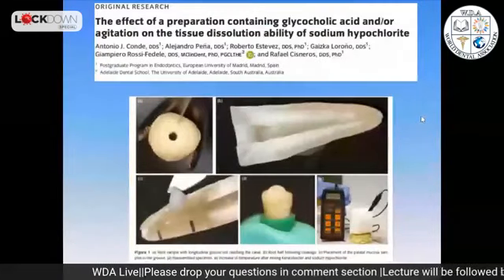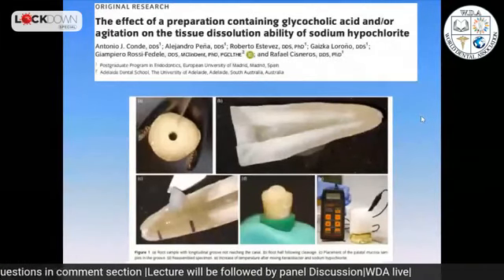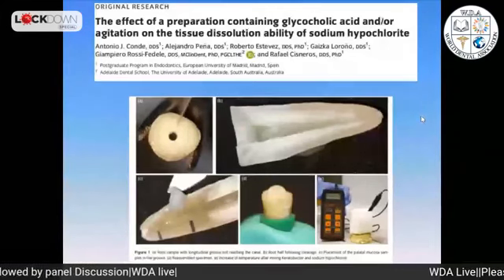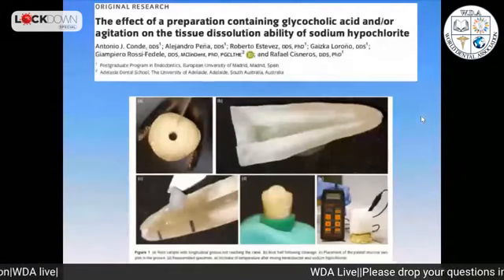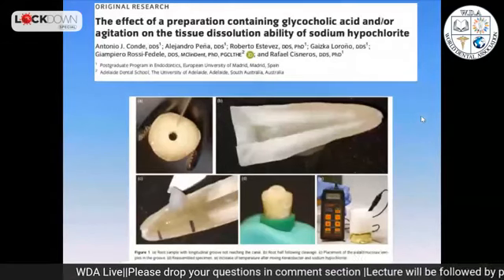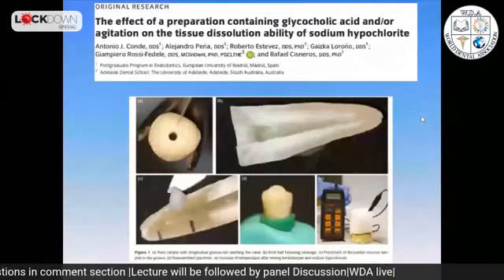We are now testing other chemicals that you mix and put inside the root canal, and then they start having tissue dissolution. They are able to increase our tissue dissolution ability. But this is heat that is created inside the canal. So as I tell you, it's not only the physics, it's also the chemistry.